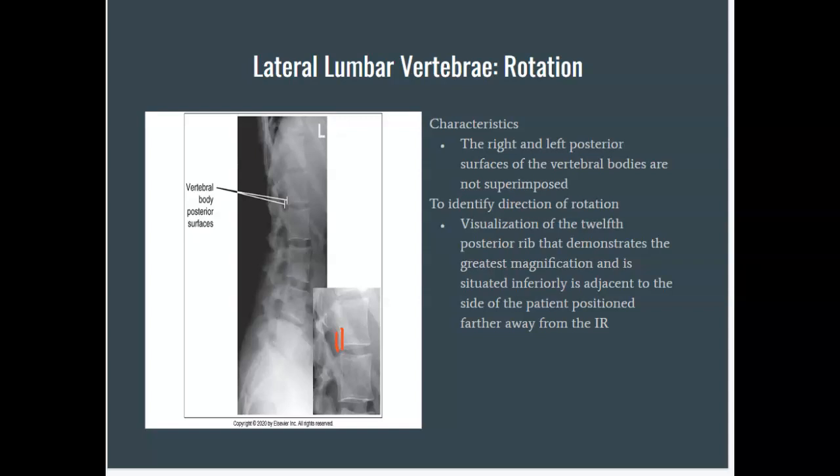A couple of reasons I know this: we can see the 12th rib coming down as a small shadow, and it is rotated posteriorly, coming out from the back end. We're also seeing the posterior surface of our L-spine, and the reason we see it is because it's getting closer to the IR as we rotate posteriorly, allowing us to visualize it. You'll see in the next projection the difference.